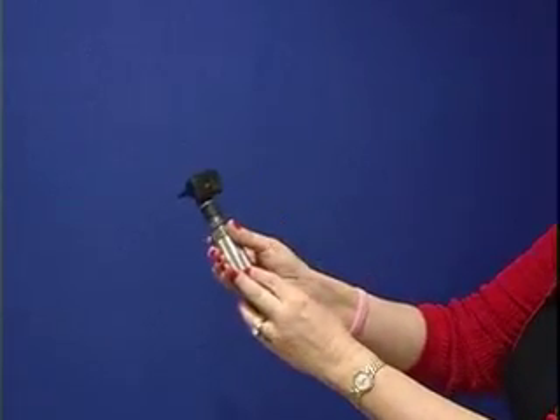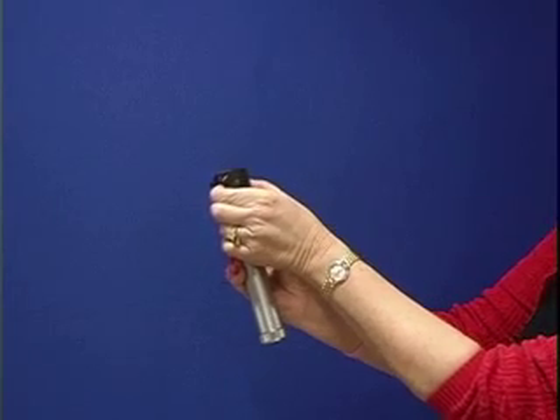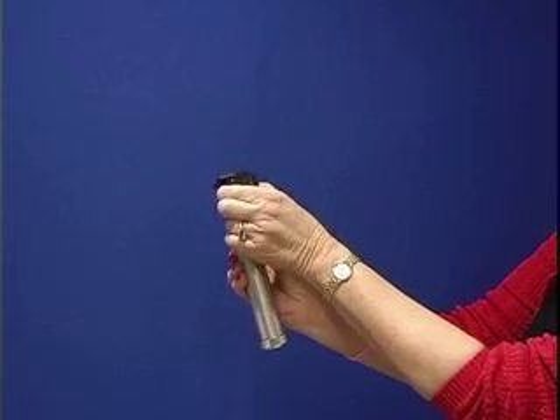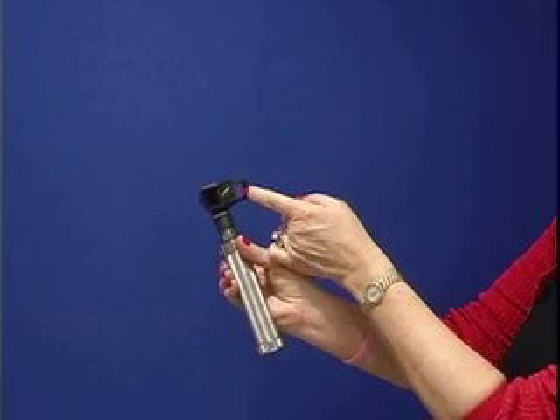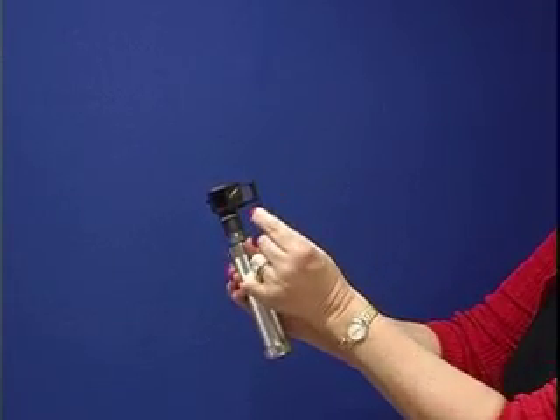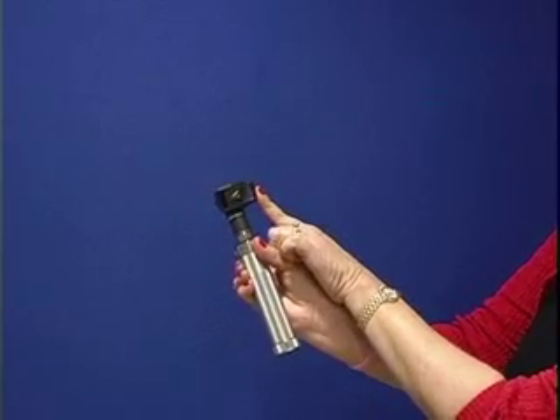This side of the otoscope is a magnifier so that you're able to see well inside of the ear and the tympanic membrane. If you were to see a foreign object, this magnifying glass could slide over and you could extract the foreign body.